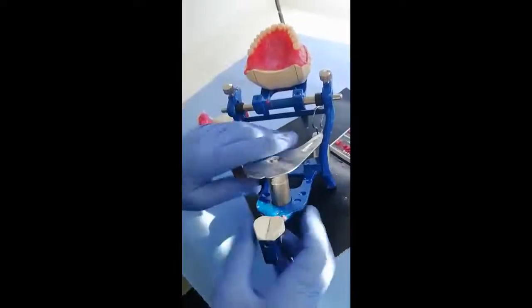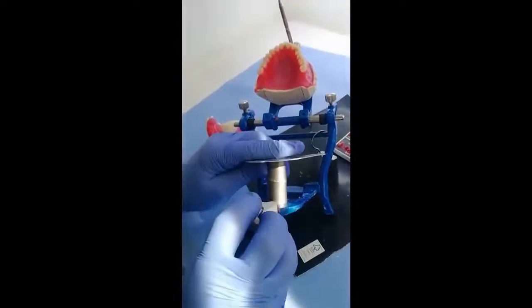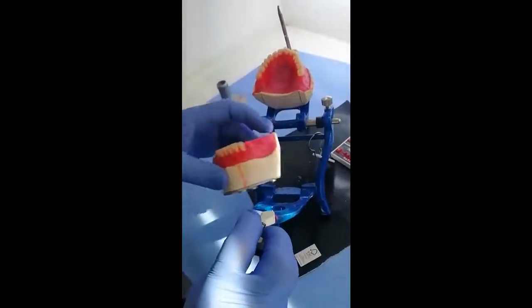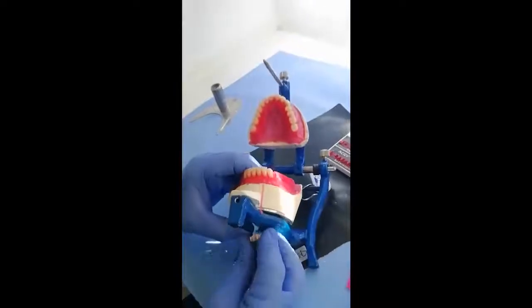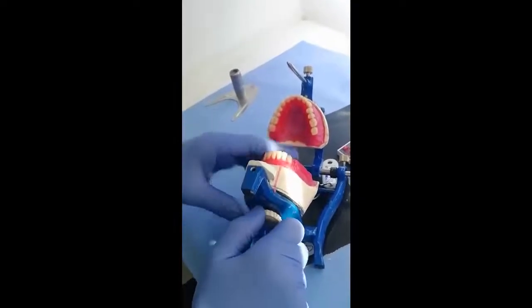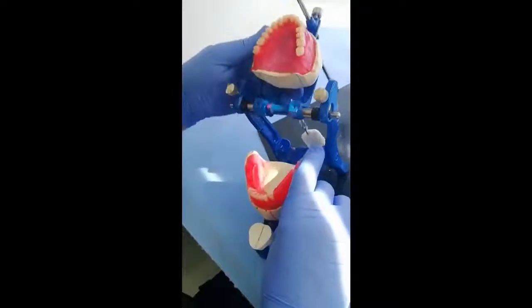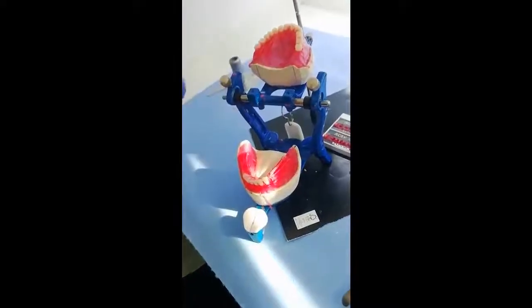Now we replace the mandibular cast again. You can see here we start setting the mandibular posterior teeth.